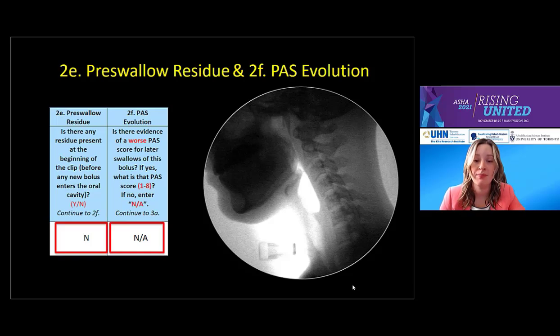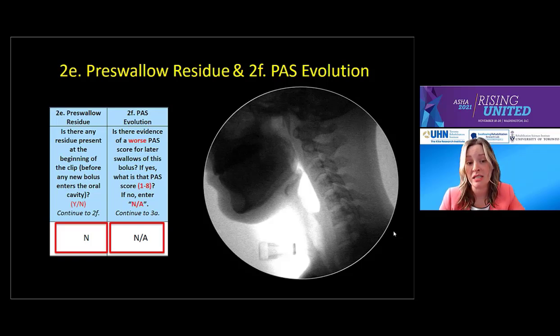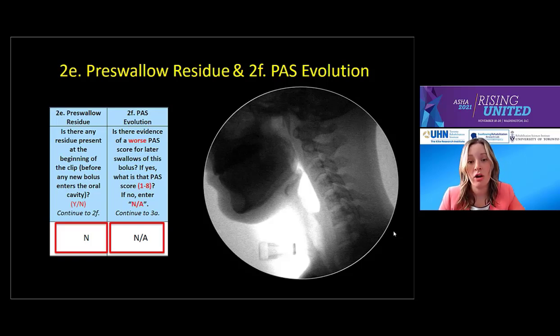Comparing our patient's value of 533 milliseconds to our healthy population swallowing thin liquids: the ASPECT-C scoring sheet shows that time to LVC should occur in 167 milliseconds or less, indicating a substantial difference. Our patient's value of 533 milliseconds is atypical and likely a mechanism of impairment. Our tool also includes a box to indicate whether there is residue in the pharynx before the first swallow — pre-swallow residue. Research has shown that the presence of pre-swallow residue doubles the risk of penetration or aspiration on subsequent swallows. In our patient's case, we don't see pre-swallow residue, so we write N on our worksheet.